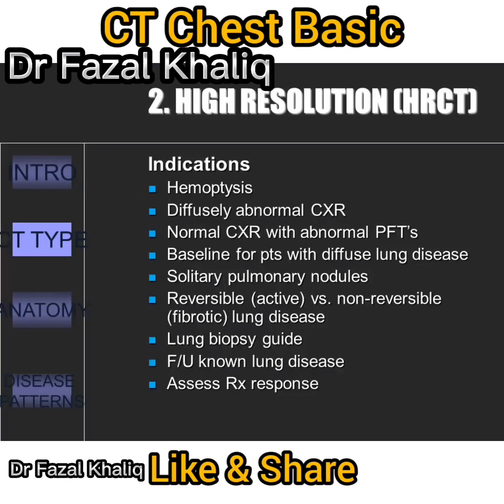For parenchymal disease, it is important to get as detailed a look as possible. High-res CT can detect and diagnose individual diffuse lung diseases, like sarcoid, hypersensitivity pneumonitis, and pneumoconiosis, like asbestosis or silicosis. It also has greater diagnostic value in certain diseases that involve the airways and pulmonary air spaces, like bronchiectasis, allergic bronchopulmonary aspergillosis, cystic fibrosis, and emphysema, to name a few.